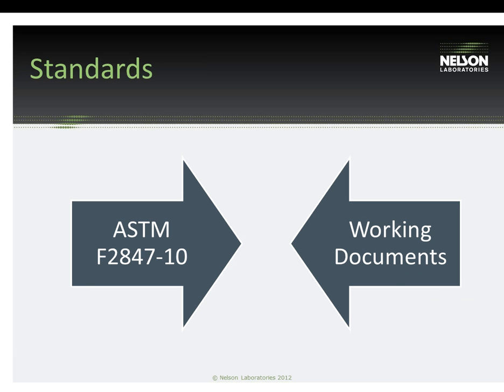Also to note with this working document, in the last ASTM conference that we attended, we do not think that this working document will actually set a limit and actual numbers, but it'll just be more guidance on how to go about setting those limits. And so it will still be up to the manufacturer, in our opinion, to justify that overall test plan and clean devices. But we wanted to mention these two working documents, we're watching those to come out in the future.